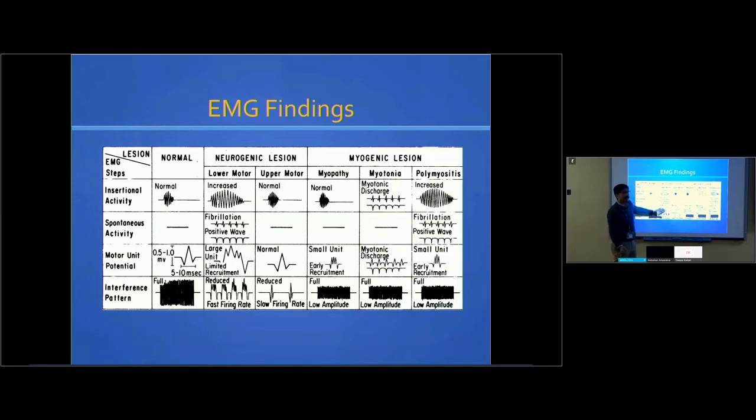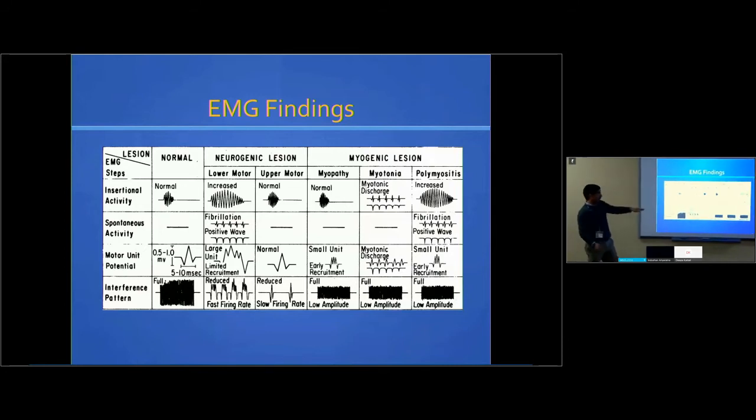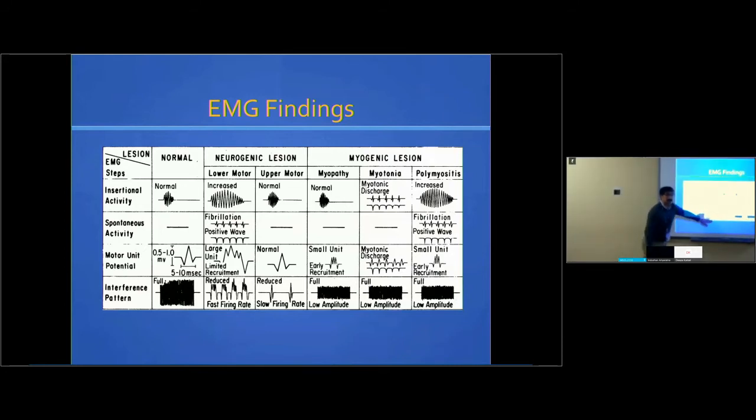And so in case there was reinnervation, which means you lost some axons going to that muscle and then these friendly next-door nerve fibers have taken over the muscle, the units become wider, they become bigger, and they have more phases. And that tells us some reinnervation happened. Now, if the amplitude is very small and the recruitment is reduced, then we know that this reinnervation happened in the last few months only.